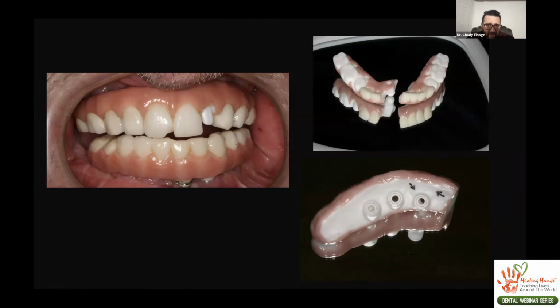It happens to everybody. It could be anything from the puck of zirconia that you buy from the manufacturer, to the steps in the lab, or even your adjustments on the day of delivery, for example. There's a lot of factors that can contribute. Unfortunately, it's very hard to figure out why these things happen in a lot of cases.